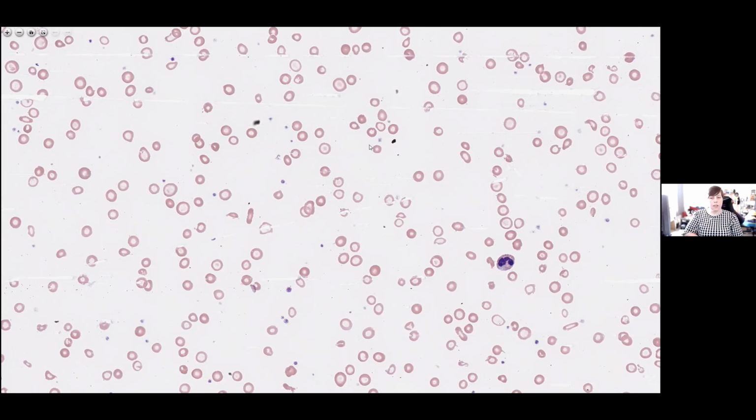So comparing this situation, which in my mind is probably a severe iron deficiency caused by chronic blood loss, as people pointed out in the comments, in an acute situation you would not expect to see microcytosis, because it is the iron deficiency that is causing the microcytosis. You would more expect to have macrocytic indices. The reason is that in a young, healthy person, the bone marrow would be able to compensate for a rapid drop in hemoglobin by pushing out polychromatic cells and nucleated reds. Those will push up your MCV.